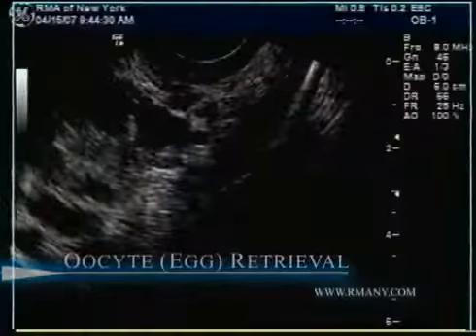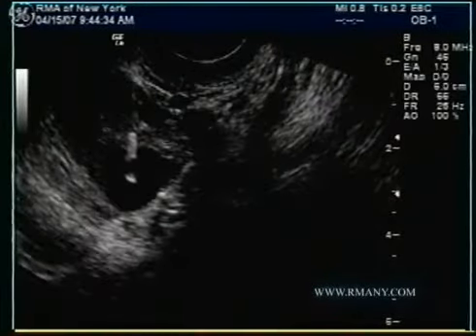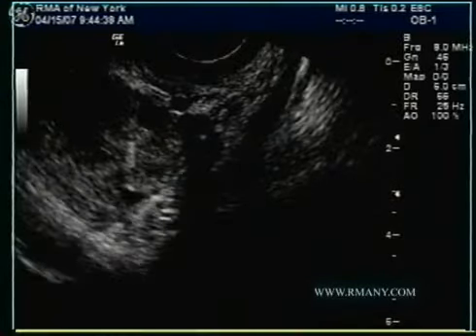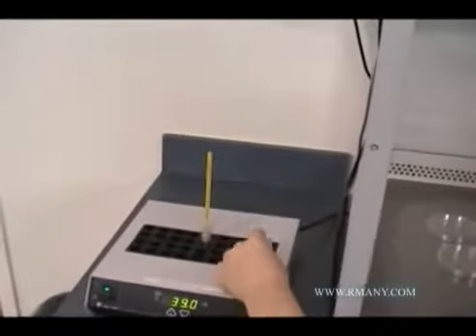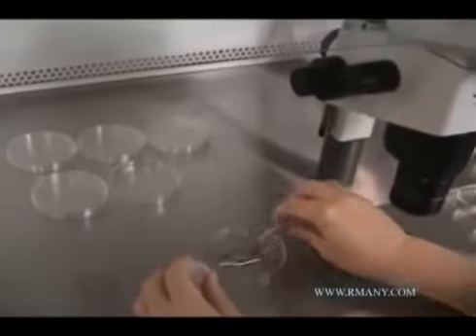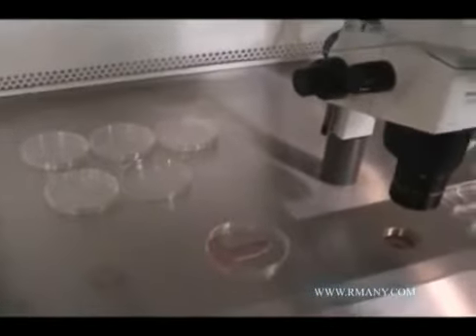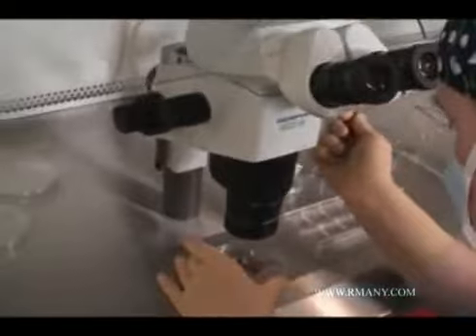The first procedure most patients undergo is an egg retrieval. After your identity is verified by an embryologist, a reproductive endocrinologist aspirates the fluid contained in each of your ovarian follicles. The follicular fluid is collected in a pre-warmed test tube. The test tube is brought into the embryology lab, where an embryologist pours the fluid into a dish located on a warm surface, and then searches through the fluid to locate the eggs.